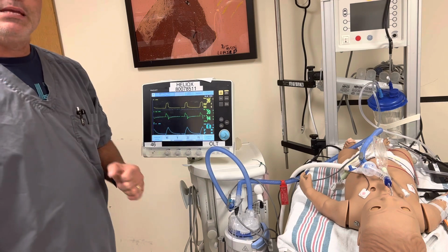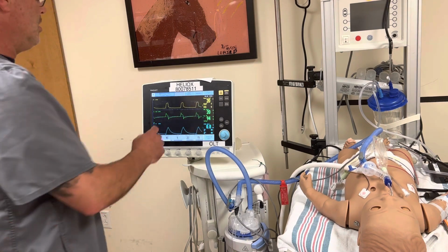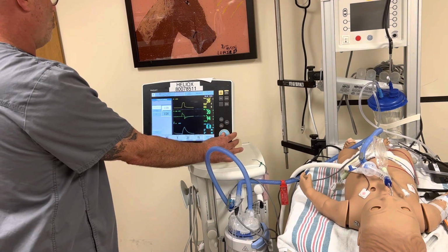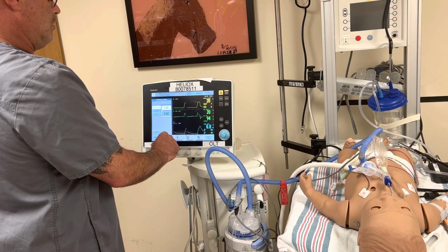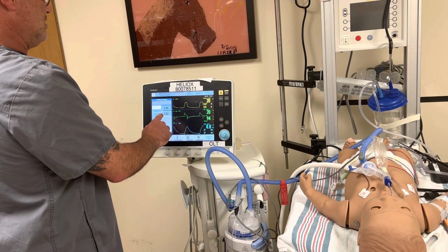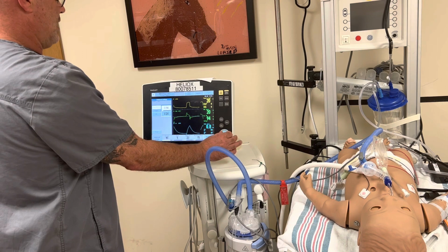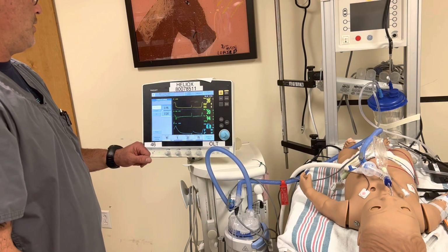But you have to be able to get to zero flow on the waveform within that time frame. So the first thing I'm going to do is come in here and start right off the bat setting my I time breath by breath until this flow gets to zero, right? I know this mannequin needs a 0.95 second I time in order to get to zero flow in these settings.